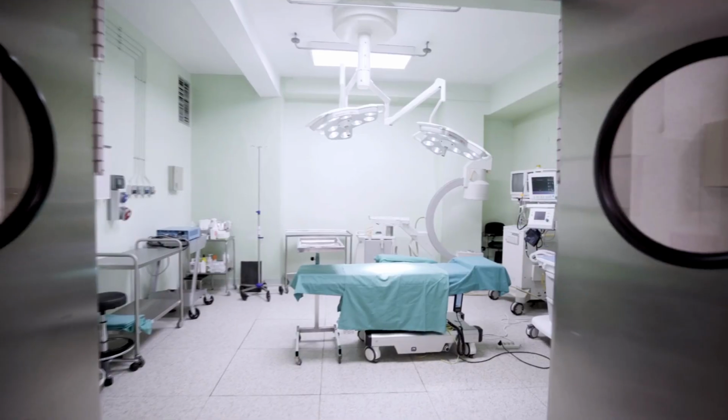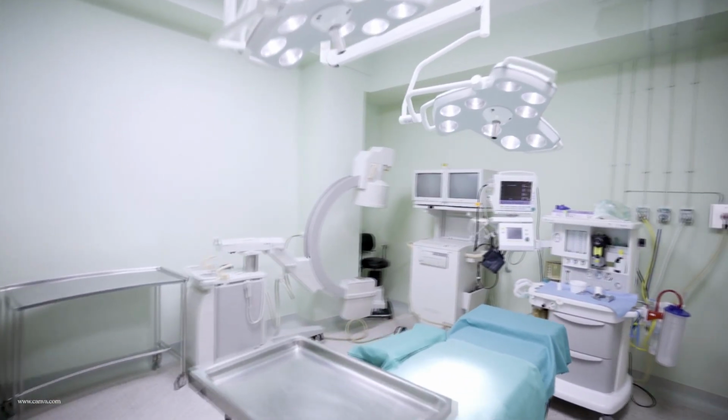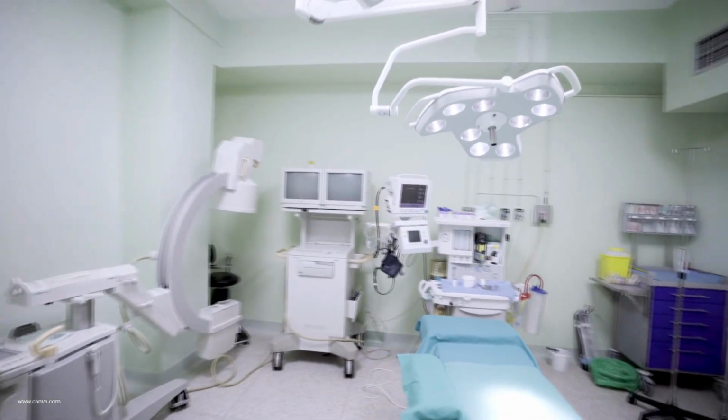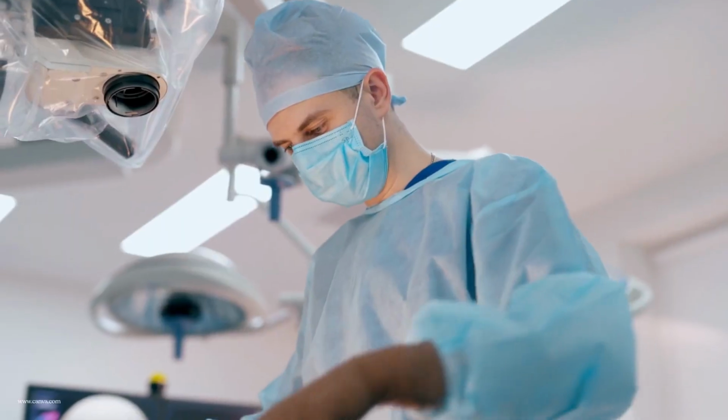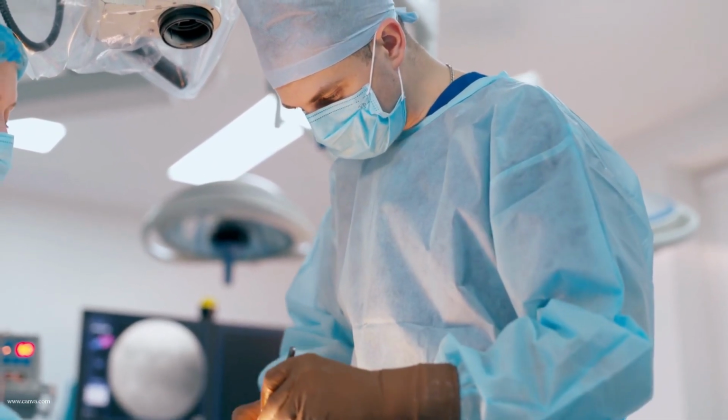If you take anything away from this video, let it be this. Your success in the OR begins when the first image is taken. Never wait until the case starts to enter the patient information. Do it early, double check it, because once the procedure begins, your attention needs to be on the patient and the surgeon, not on the keyboard. Focus on mastering your workstation setup and you'll quickly become more confident, more efficient, and more trusted in your role. Start applying these steps in your next case and you'll feel the difference immediately.